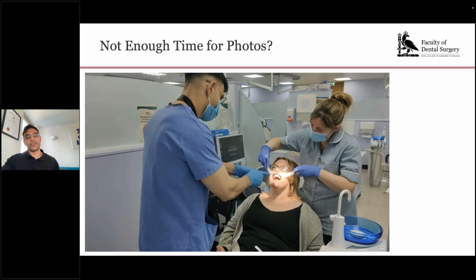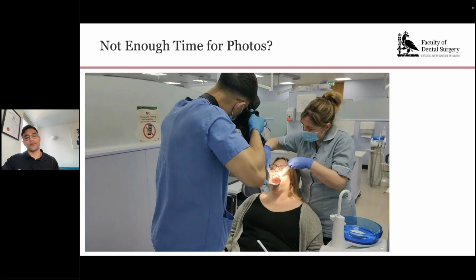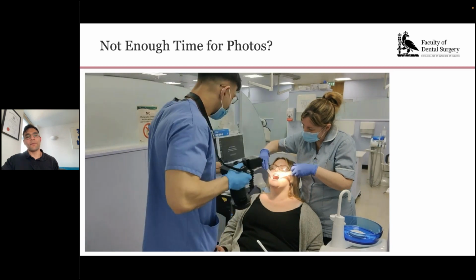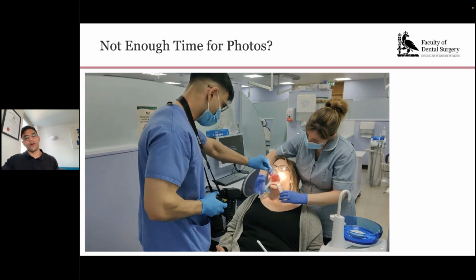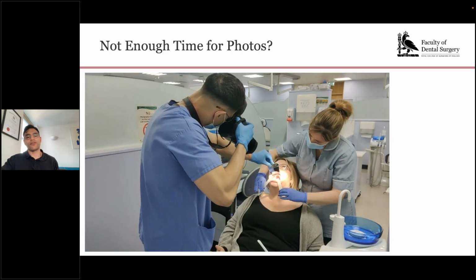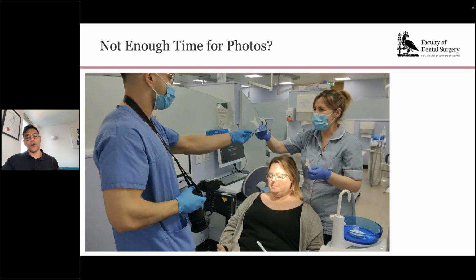The upper lip is retracted, the mirror goes in one corner at a time, so you don't rip the lips open as you put it in. And it's a long mirror, because smaller ones will often result in you taking photographs of your fingers because they'll be closer to the teeth. So a longer mirror is better because it allows you to get your fingers and thumbs out of the way.